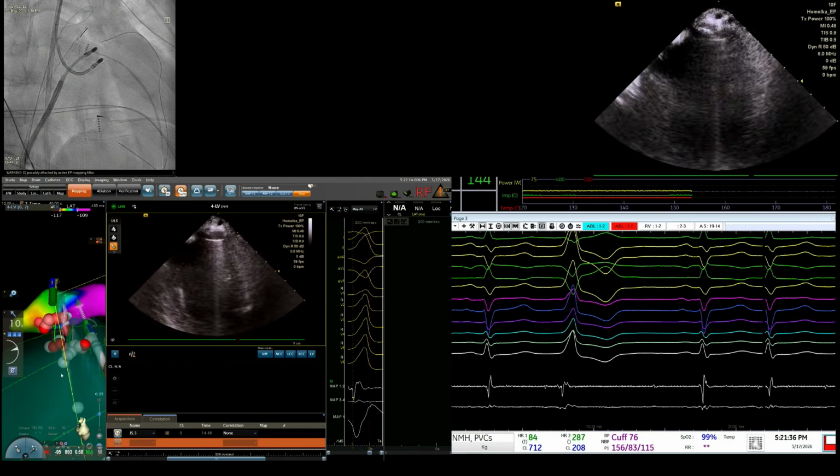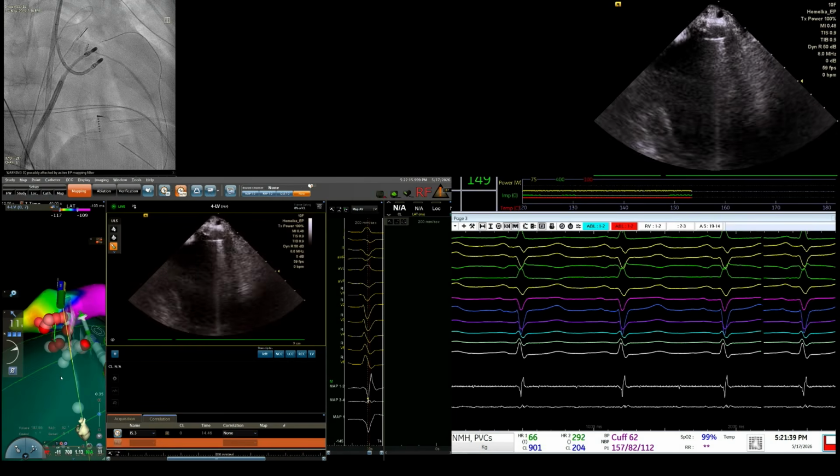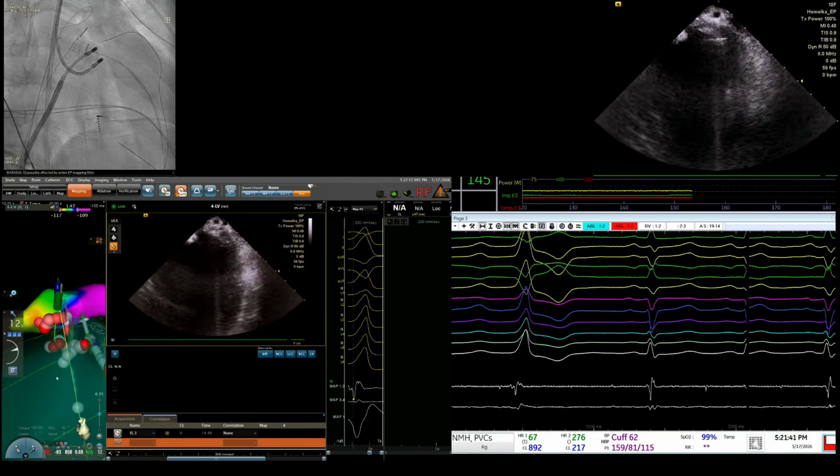I still want to face you with one fact. First off, I fully agree with what you have said in your lecture. However, with pulse field ablation, if you have an area that was previously thick and it was ablated with pulse field ablation, we know from the animal lab data that PFA is causing serious tissue thinning. And it might be prudent to go back to the same area and do everything the same, because now you're not facing exactly 10, 11, 12 millimeters of tissue thickness, you're facing tissue that is down to 6 or 7. So it's a different target.